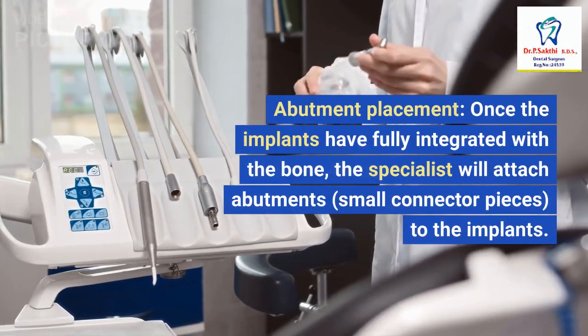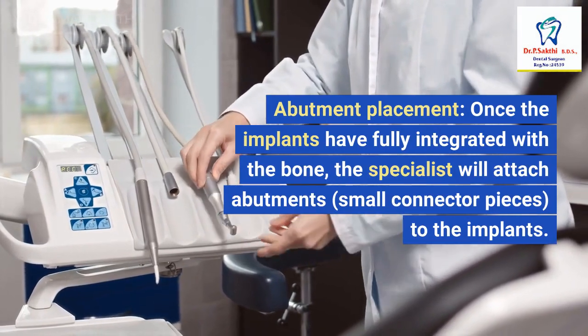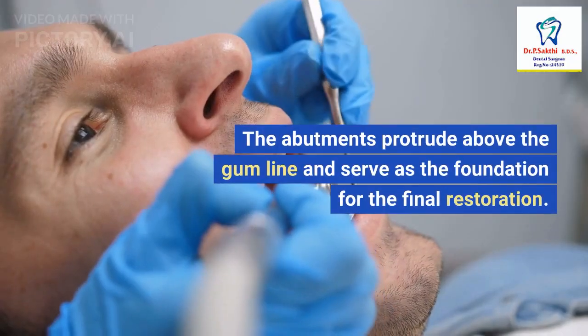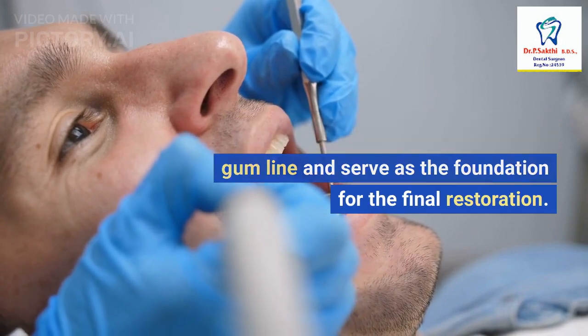5. Abutment Placement: Once the implants have fully integrated with the bone, the specialist will attach abutments — small connector pieces — to the implants. The abutments protrude above the gum line and serve as the foundation for the final restoration.